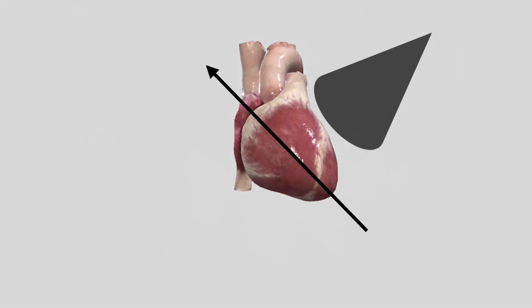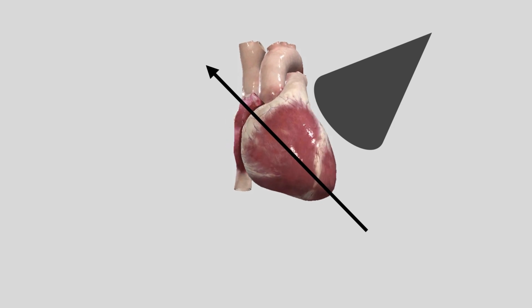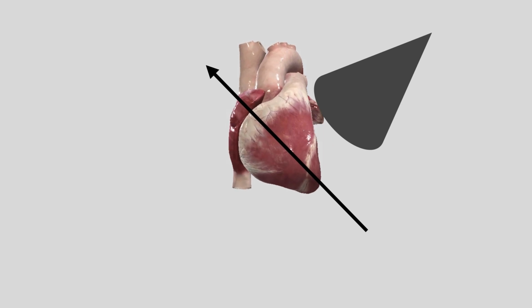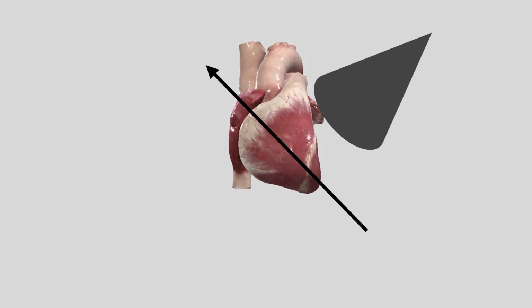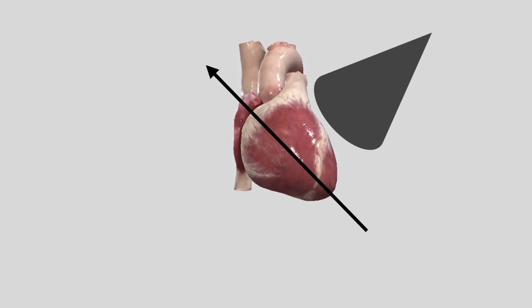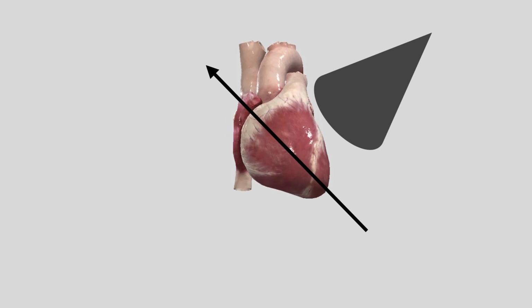So if you go to more of a model perspective, the parasternal long axis window is viewed from the anterior chest wall, as its name implies, parasternal, just alongside the sternum. It's going to be in an oblique orientation relative to the patient's surface anatomy, right? So the probe indicator will go towards the patient's head or shoulder, and the other end of the probe will be going towards their hip in this long axis view. When people ask me, what angle do I need to put it on? I say, just imagine the heart in the body. Look at the patient, right?